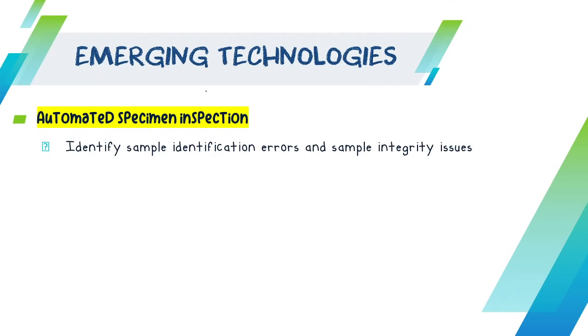It is for identifying sample identification errors and even your sample integrity issues. So unsa man ning mga common sample integrity issues? Like for example, hemolyzed inyong sample, mao gyud ang number one. So with automated specimen inspection, it is able to check or verify na inyong sample hemolyzed. Unsa pa man ang mga problems, lipemic, icteric, so kana mismo na machine ninyo, they can already check kung unsa kagwapo ang integrity sa inyuhang sample.